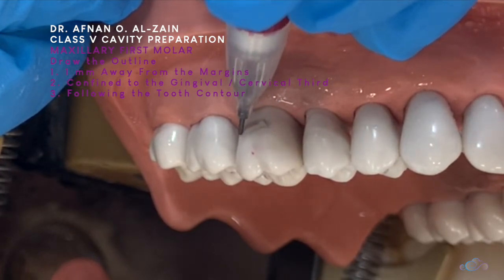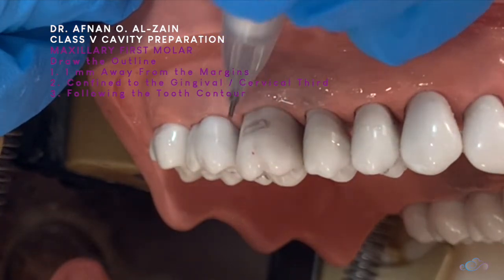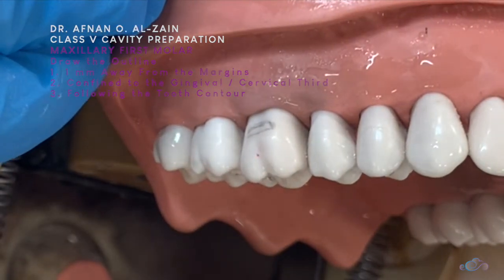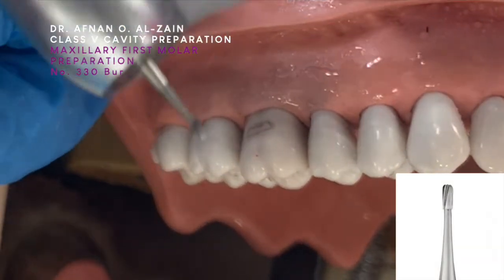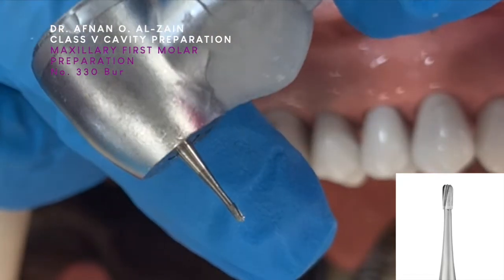The shape will be more parallel and broader, to follow the same contour of the tooth — the same outline as the tooth. Then we're going to start making the cavity. We're going to use a 330 bur.